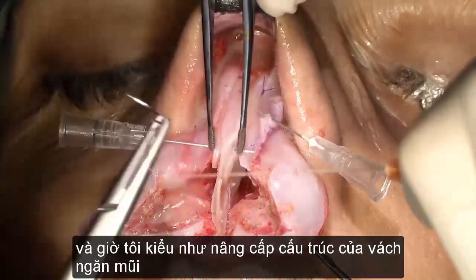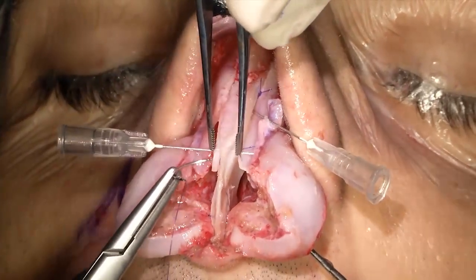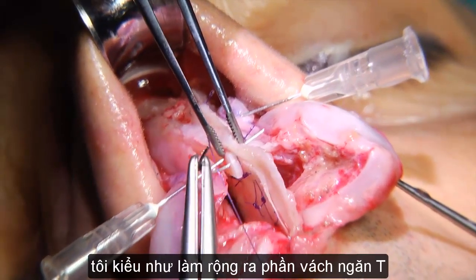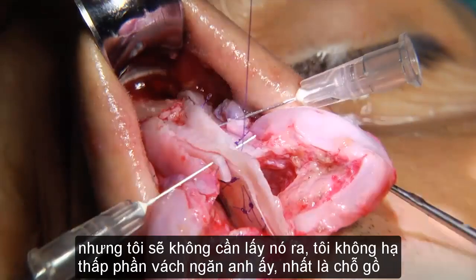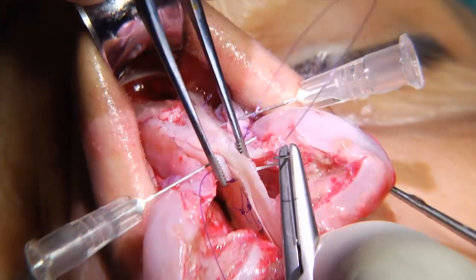So I'm kind of boosting the architecture which the septal T has on its own, all right? I'm kind of widening the septal T, but I didn't have to take it out since I'm not lowering her hump, his hump.